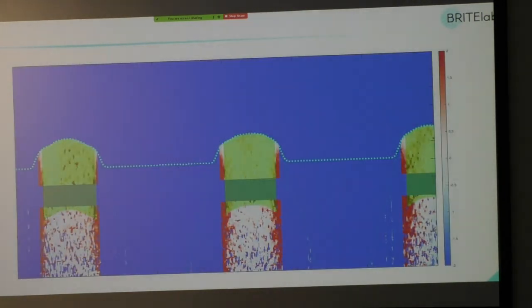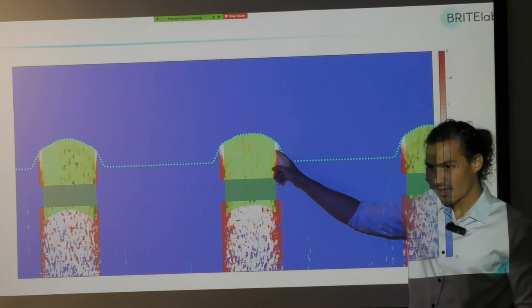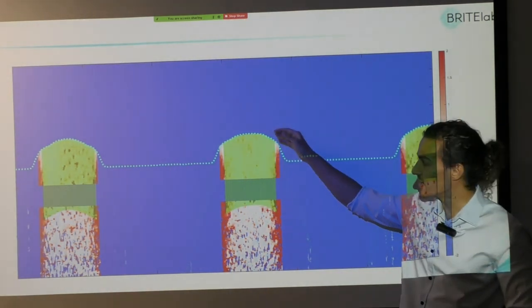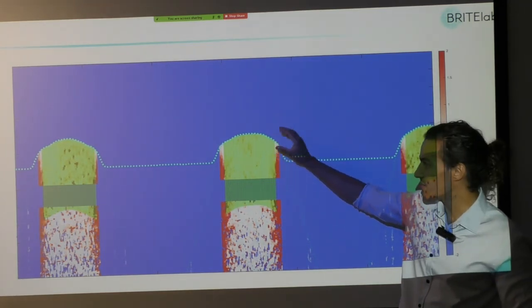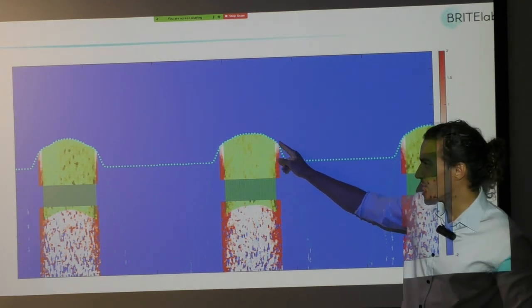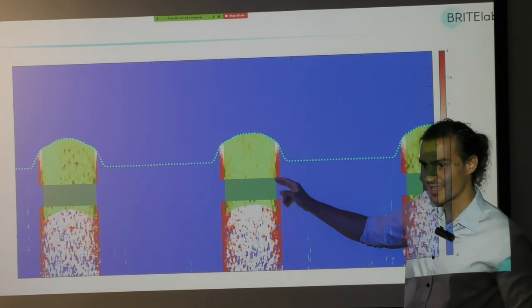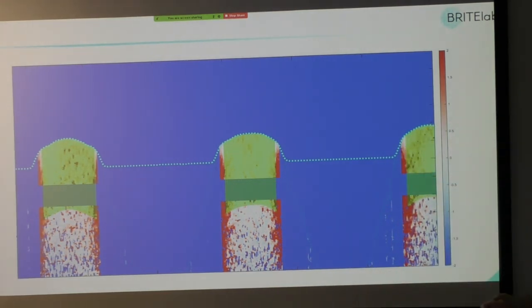This is because, as we look at our largest amplitude phantom, remember these higher areas of strain that we had before. Because there's a higher area of strain there, it looks like there's a lot of force around that area, and because there was a lot of movement, we estimate this as a softer region, whereas everything below it is overestimated. And these get included within our region of interest. So it's due to that impact, which is why you see it decrease over compression.